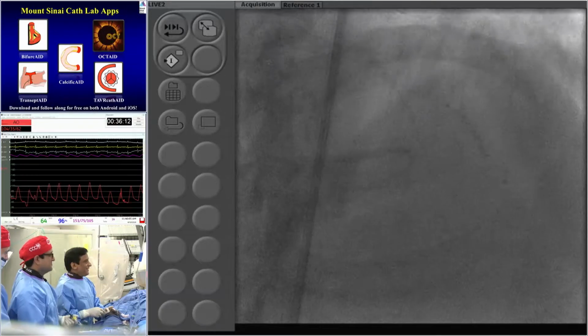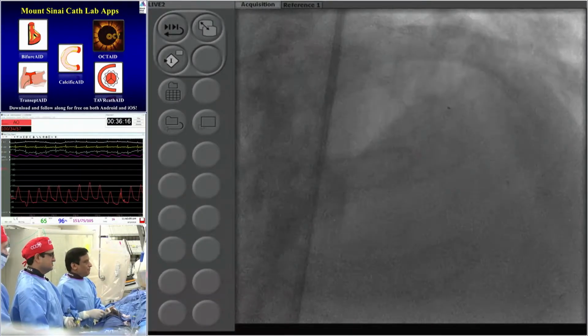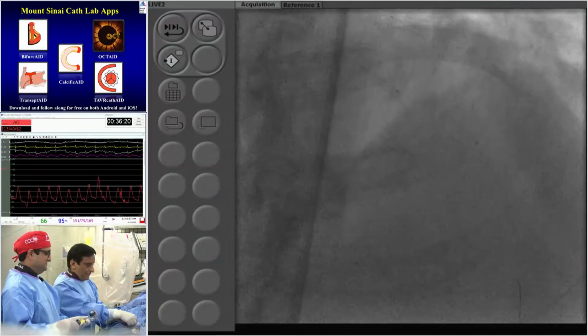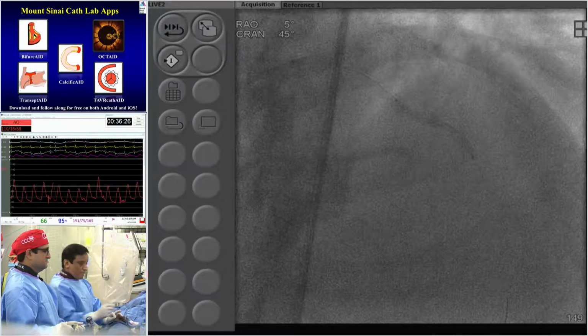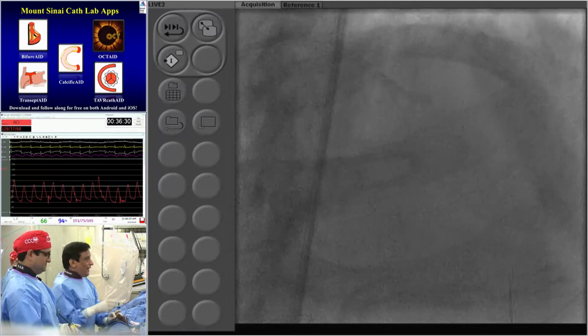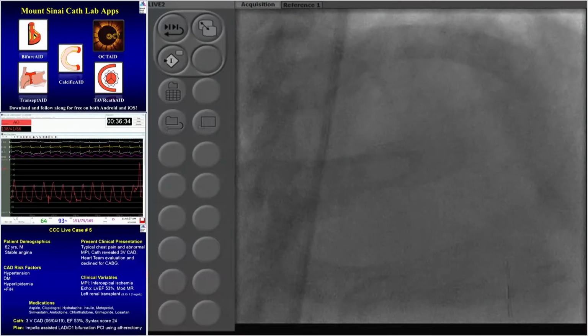With the orbital, I think we had to change the symposium, because every case is atherectomy. Go up, and I'll tell you why. Very rarely is any symposium more than 50% atherectomy, and we are actually close to that so far. Case number 5 is another atherectomy, and then case number 6 will be now.